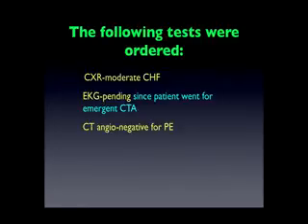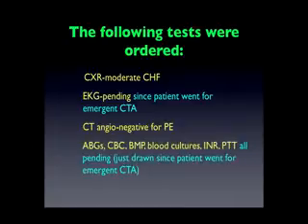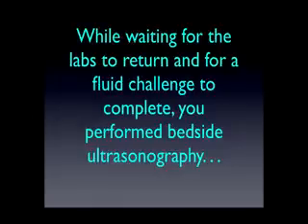The patient did come back, and the CT angio was negative for pulmonary embolism. Once he arrived back, ABGs, CBC, BMP, blood cultures, INR, PTT were drawn and are all pending. While waiting for the labs to return, and for a fluid challenge to complete in view of his hypotension, you performed some tests with bedside ultrasonography.